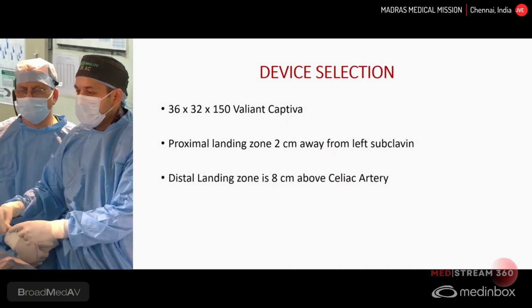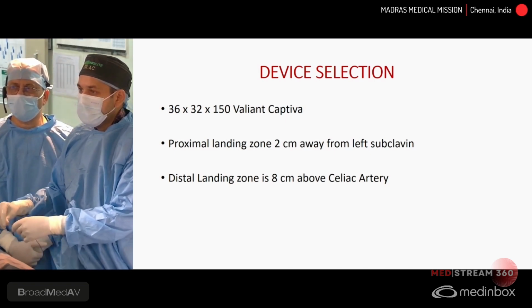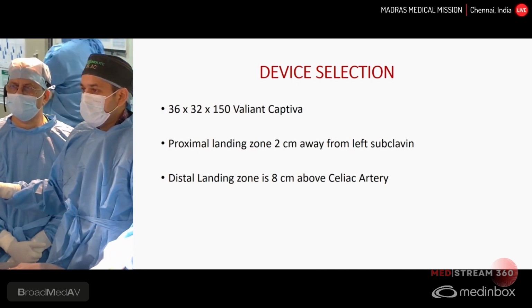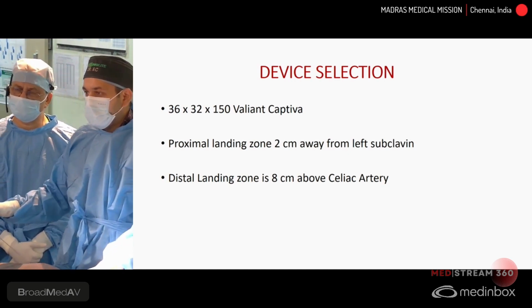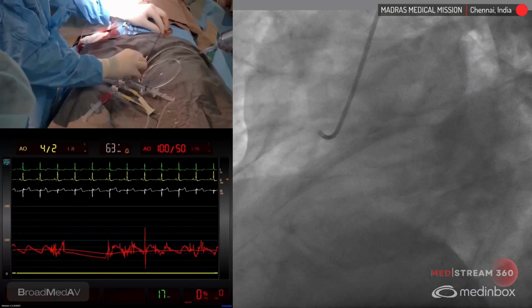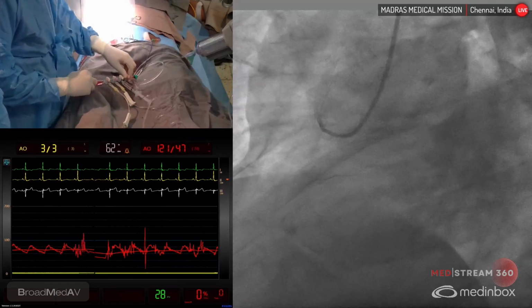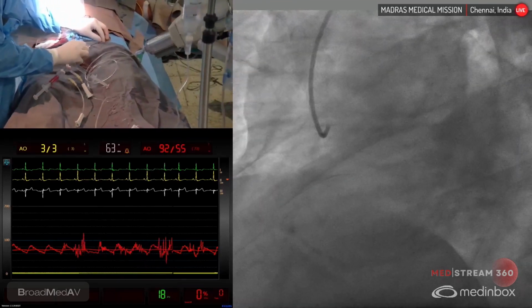Initially, first we are planning to do a coronary angiogram because previously we had a bad experience of doing a primary after a TEVAR procedure. Since he is hypertensive, 61 with evidence of atherosclerosis, we are going to do an angiogram before proceeding. What is our plan now regarding coronary artery disease? Are we going to fix it first and then go for the endovascular, or at the end of the same procedure, or would you like to stage the procedure?